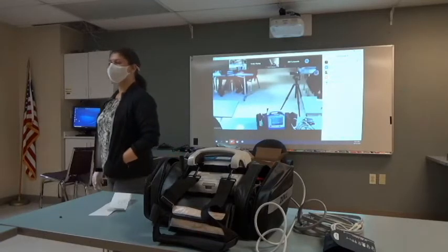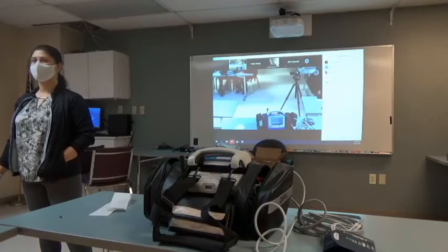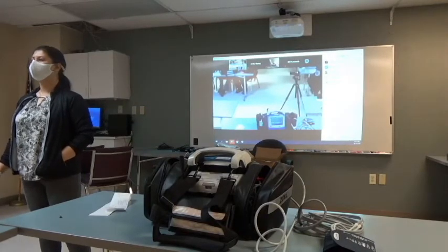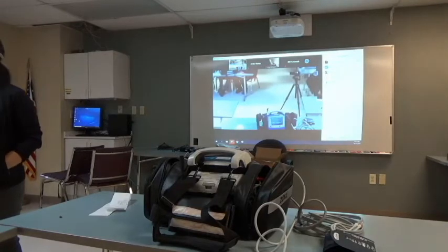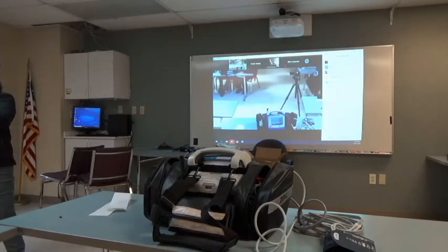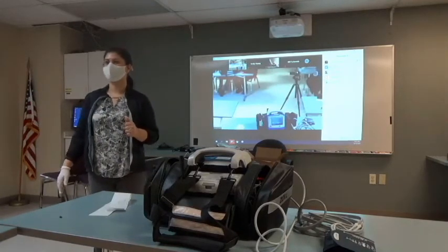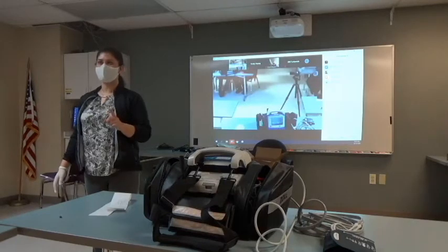When it's done, it's going to give us a disclosure log complete. You'll just acknowledge it with an okay. Because we're using my cell phone, it's probably going to be really, really long, so if you want to cancel it out for the sake of time, we can. It was really just important that you went through the button pushes for this. Any questions at all?